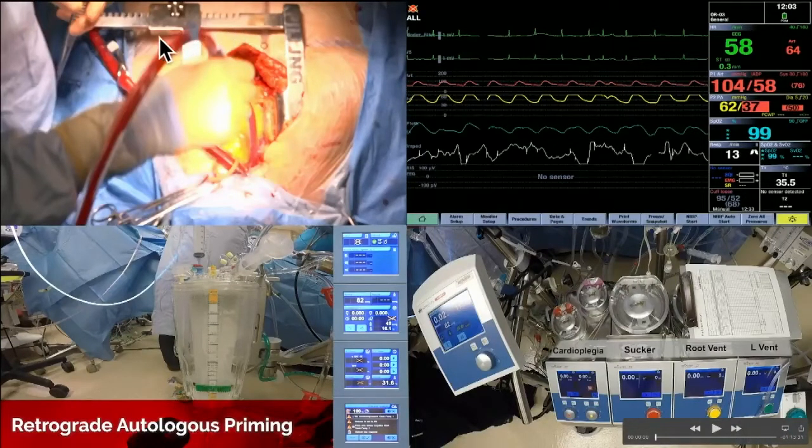But here's the operative field, exactly. And you get to see a lot of the operation here. Here is the hemodynamic monitor. So you've got the EKG, the arterial waveform, the pulmonary artery pressure, the CVP, the pulse ox, and over here the relevant numbers associated with what those waveforms are showing. And then down here in the left corner is the oxygenator that you're going to see there.